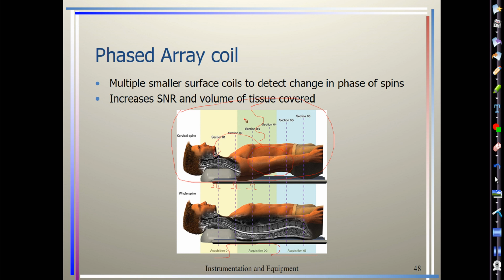And on your Siemens scanners, you probably saw maybe some of the text hit those little sidebars that are on the image. Those are your receiving coils on a phased array setup. But if you have a total spine study where you have to go from the C-spine to the T-spine to the L-spine, it's pretty cool. You don't really have to change out any of the coils. You just have to select different ones.